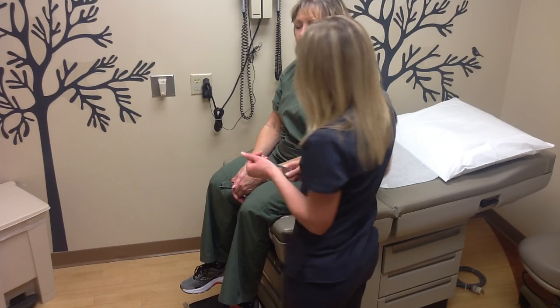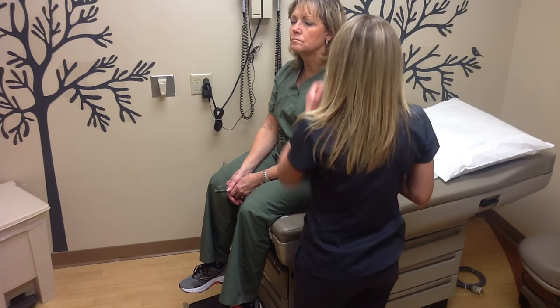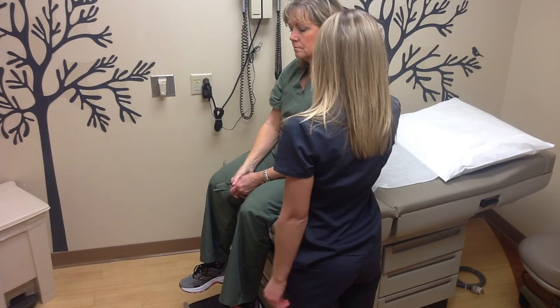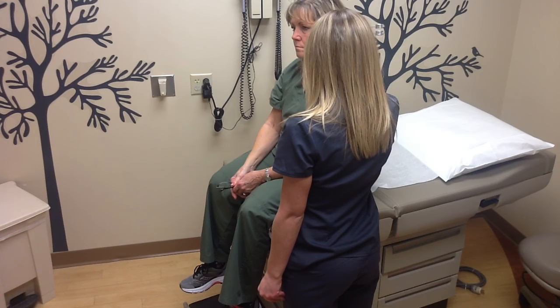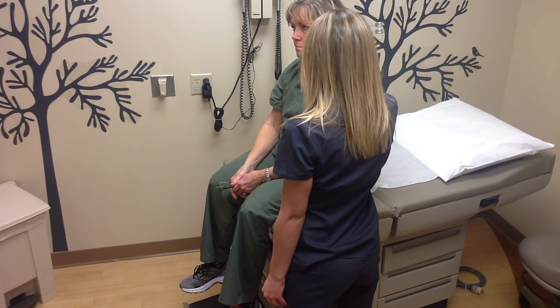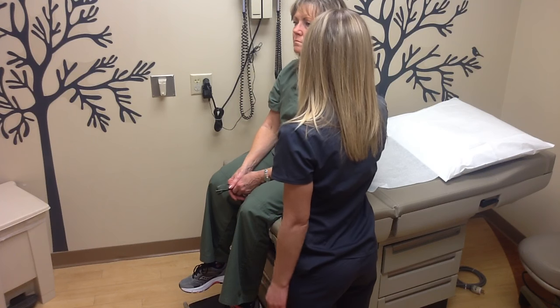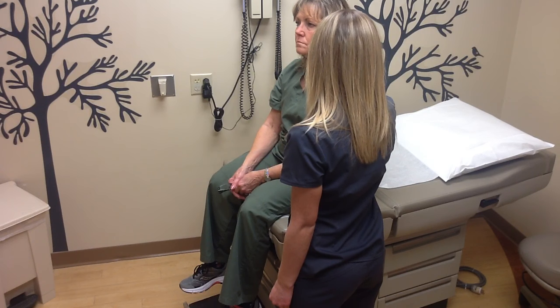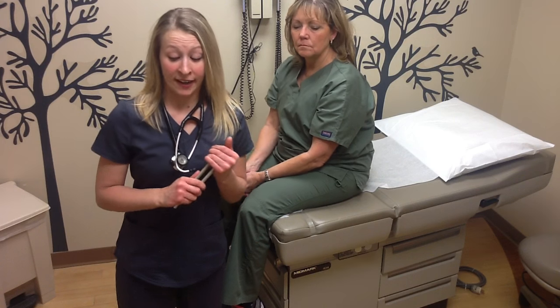Okay. Good. And next, I'm going to be doing the Rinne test on Sandy here. So same thing, just let me know when you can't feel the vibration, okay? Or hear the vibration. Okay. Good. And again. Okay. Good. Air conduction is twice as long as bone conduction, which is a normal finding.